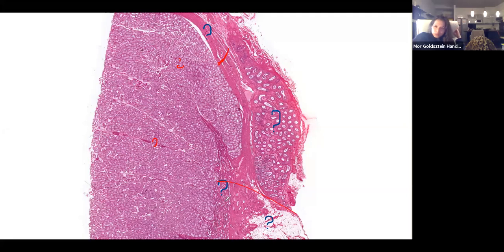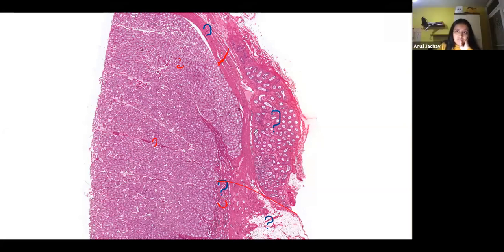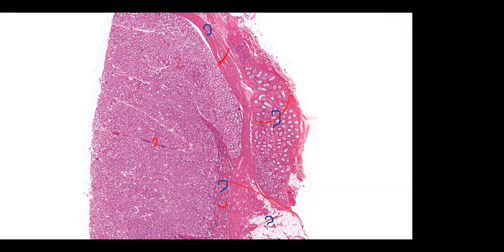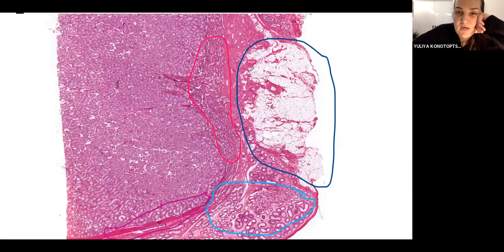Mediastinum. What are these with the irregular fluid? Rete testis. Yes. What is this? Tail of the epididymis. Very good. Tail of the epididymis, because it's upside down a bit, right? Okay, so this is the rest of the mediastinum with the rete testis, right? Seminiferous tubules, tubular recti within the septa, and this is the head of the epididymis right here. So just trying to show you that it's in a way upside down.